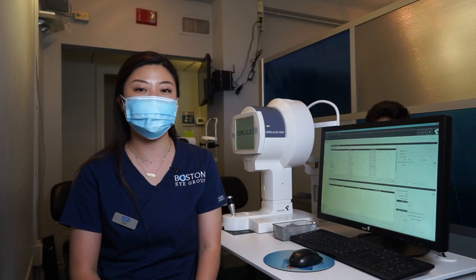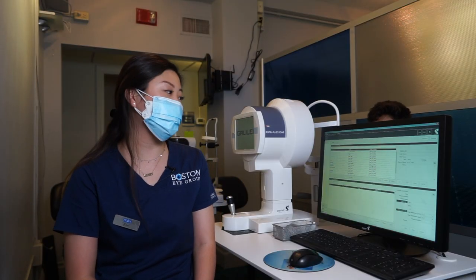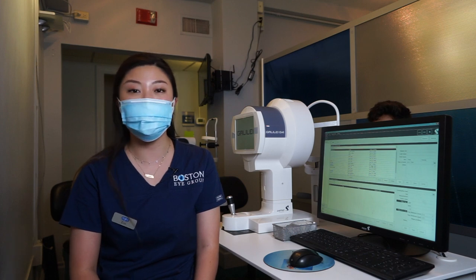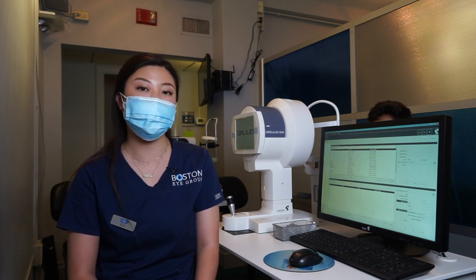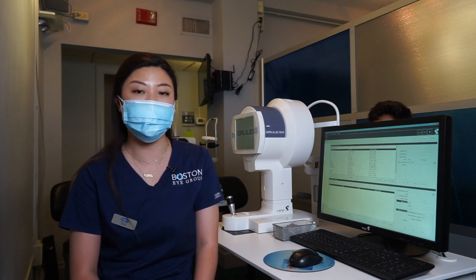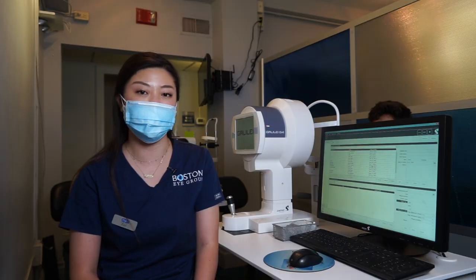This is the Galilei. It takes a topographical image of the eye. These can be ordered individually, or we use this test for LASIK consultations or cataract consultations.